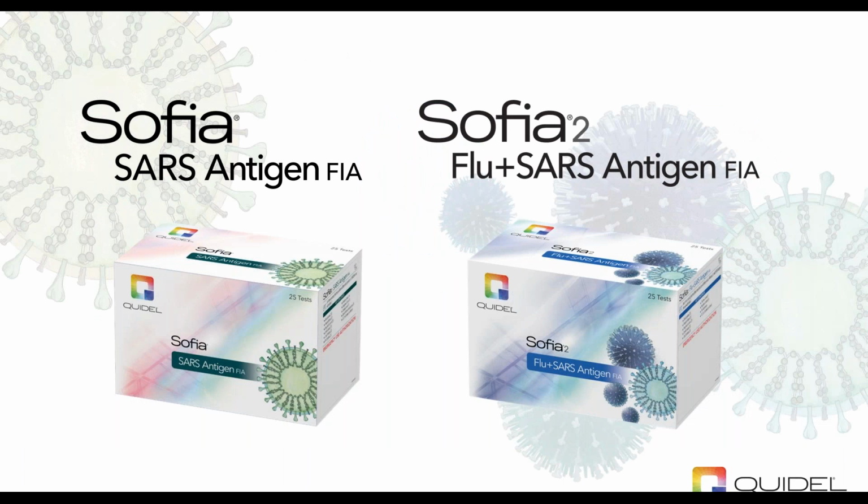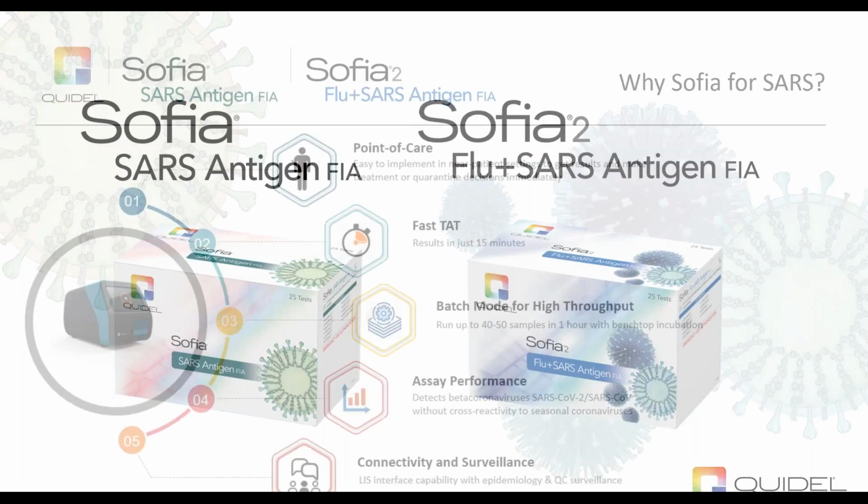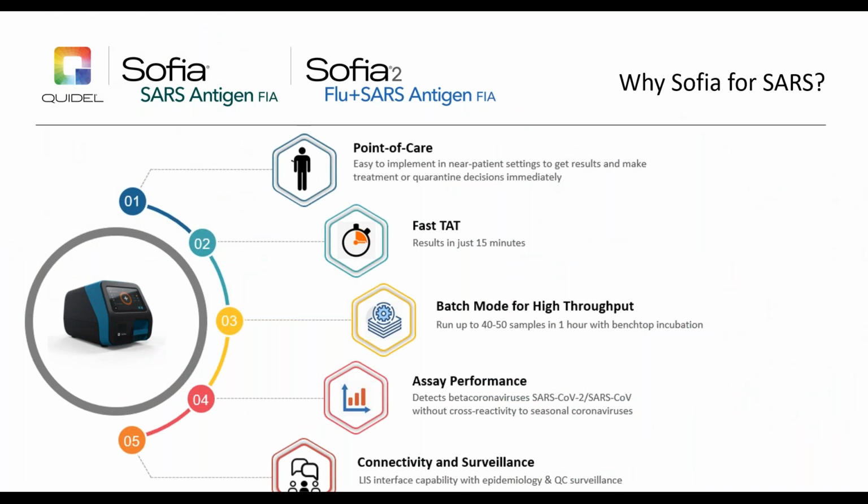So when we look at the system, there's two different assays that we have available on the SARS platform. We have the original SARS antigen FIA test, which only runs SARS, and then we have the Sofia flu plus SARS antigen test that runs both flu A, B, and SARS. And we thought we would touch on both of these since the second one is newer and just kind of bring you up to speed on that test as well, as long as we have you on this webinar today. Both of those assays are run on the Sofia 2, which you see in the image to your left.